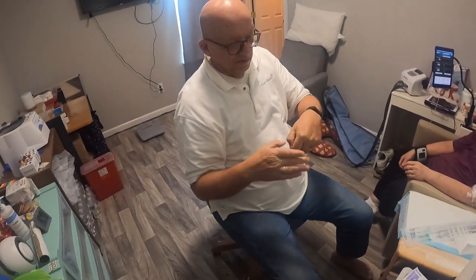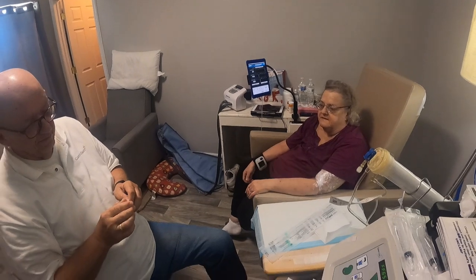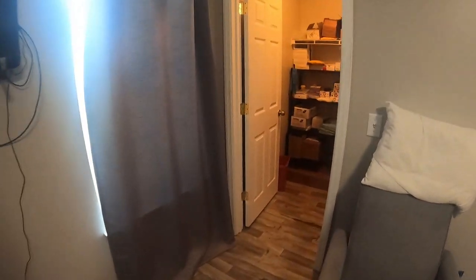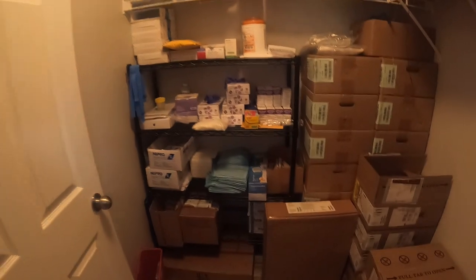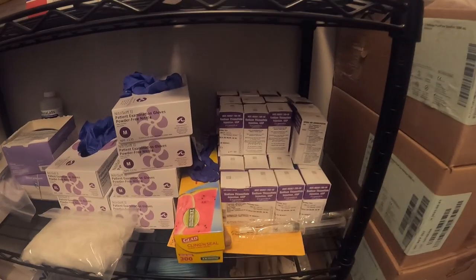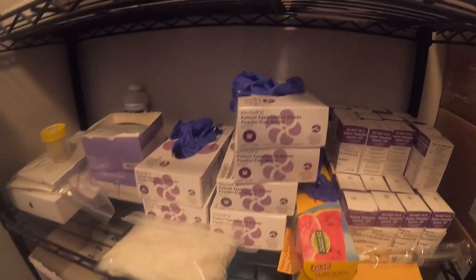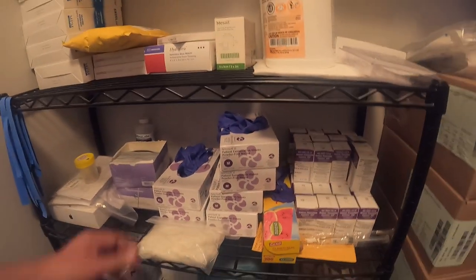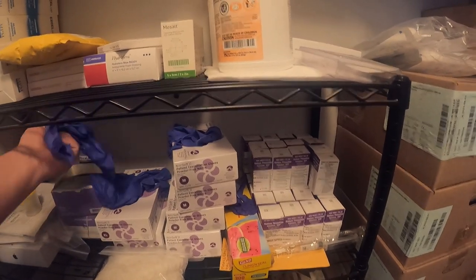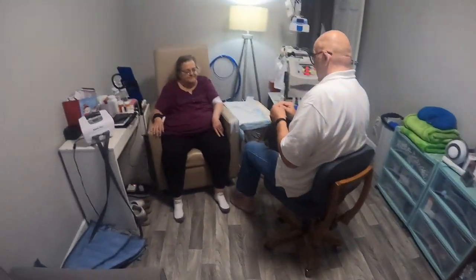We have one to go back on to the acetate to help with this calciphylaxis that's going on. Again, you go into the supply closet, second shelf down, the right hand side, there are some little blue boxes. That's called sodium thiosulfate, and we get two of those vials per treatment. That would be another time to watch, but you won't be here when we start back, so we're starting it on Monday. That's a new treatment, and this one is an existing treatment.